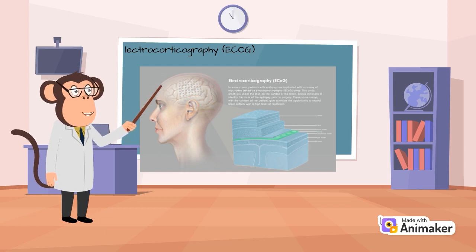Electrocorticography signals are composed of synchronized postsynaptic potentials of pyramidal cells. Temporal resolution of electrocorticography is about 5 ms and spatial resolution is about 1 cm at the cortical surface and 0.5 to 3 mm in measuring local field potential using depth electrodes.